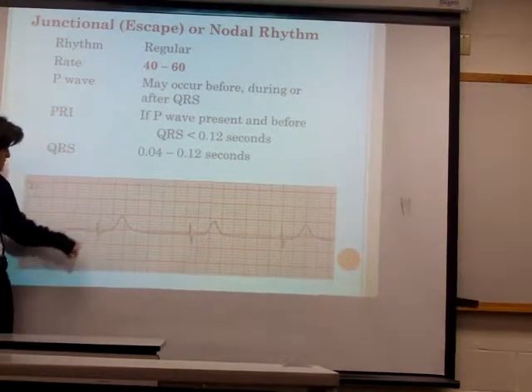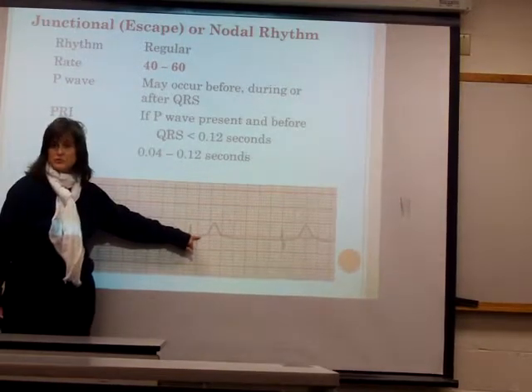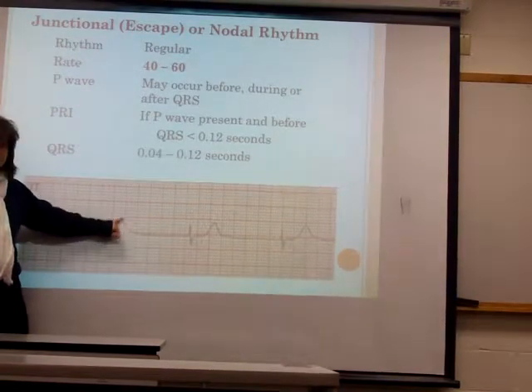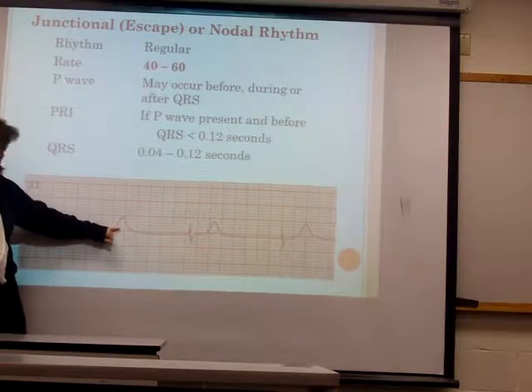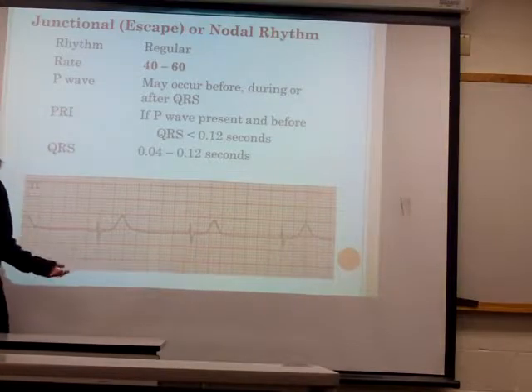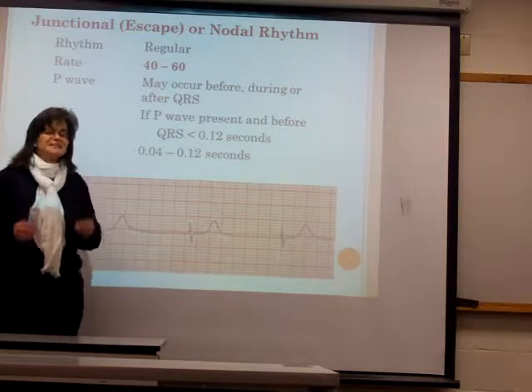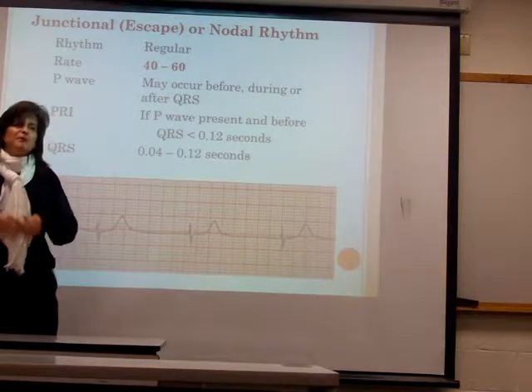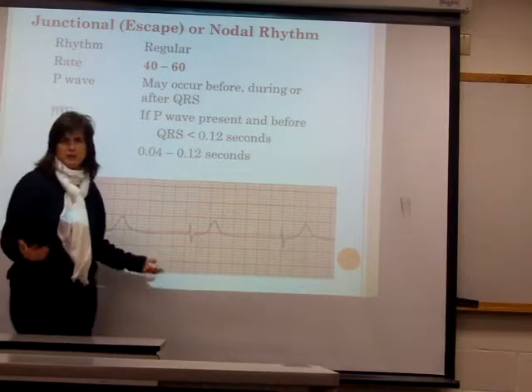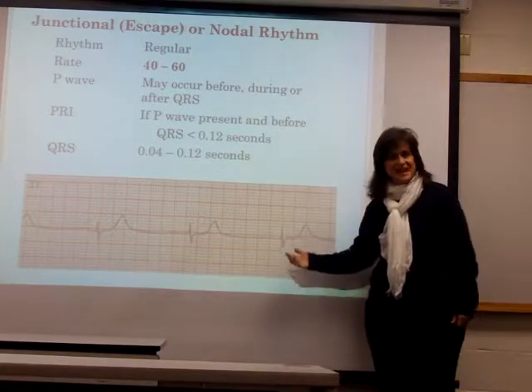We can measure the QRS. It's about 2 boxes. It does not have ST segment depression or elevation. We do have a T wave, and while it looks large, it's not peaked. It's about 5 millimeters, but it's not peaked, okay? So this is clearly a junctional rhythm or junctional escape rhythm. If you calculate this below 40, you can say junctional bradycardia, but most of your clinicians will just use junctional rhythm, okay, to denote it if it's below 40. It just means that your treatment is going to be much more on the emergent side than not.